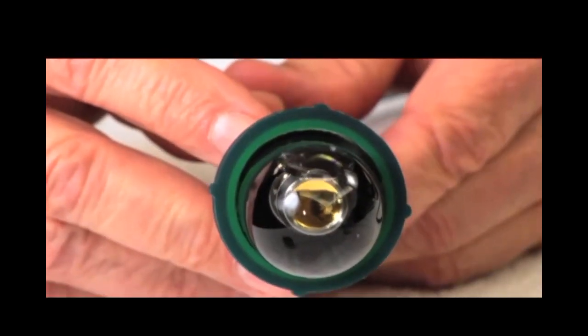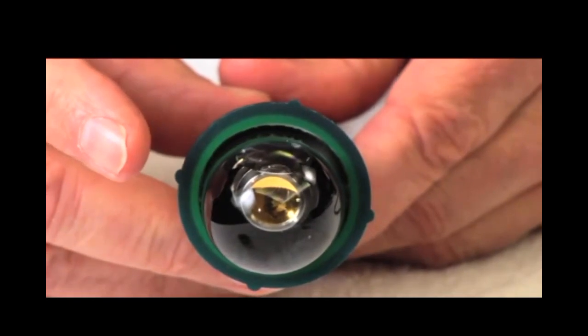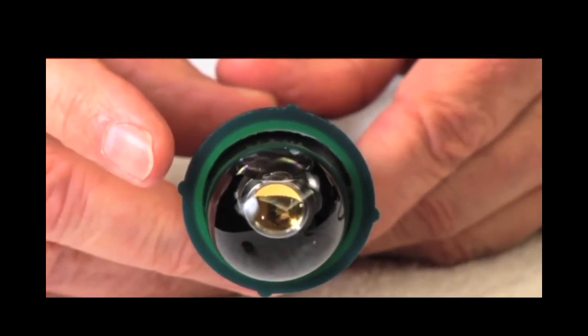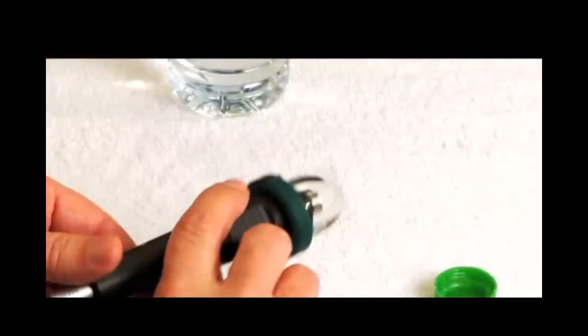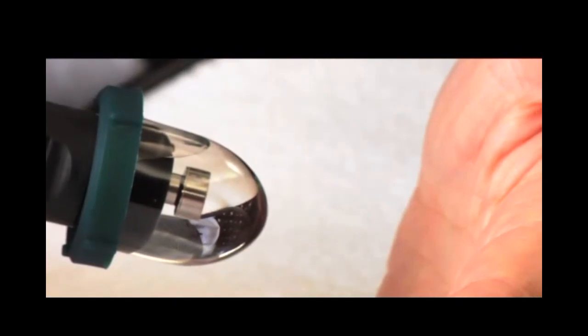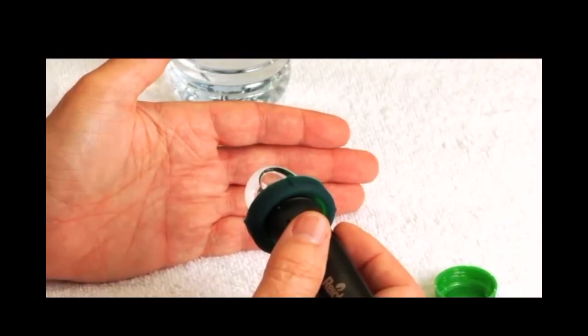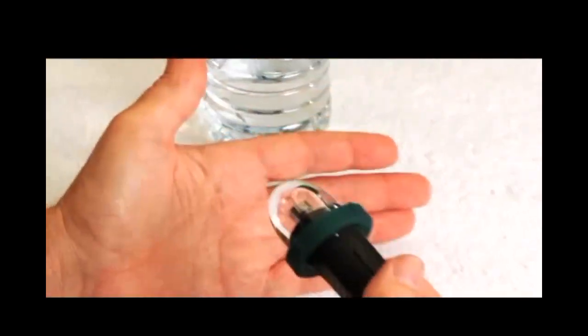What's a very important concept here in doing an examination is that the pressure within this bag has to be lower than the pressure of the eye. So the eye has pressure and this has pressure. And I want to point out three advantages to using the ClearScan. One is safety, the second is sterility, and the third is comfort. We'll just pretend that my palm is in the eye.